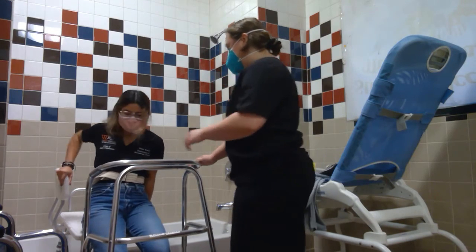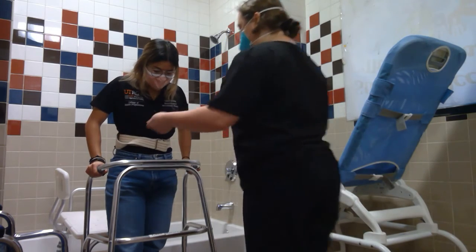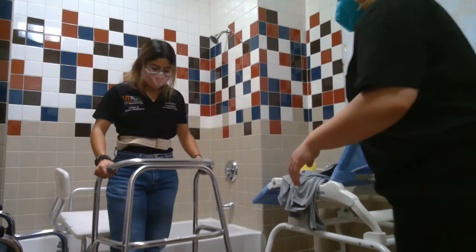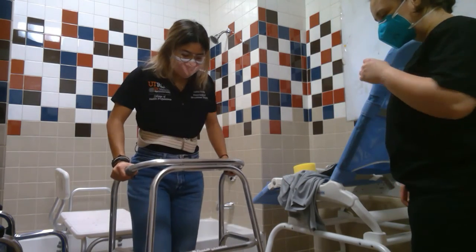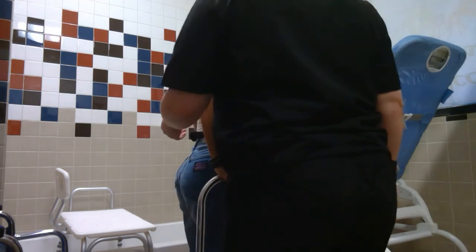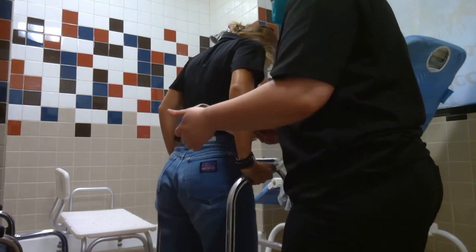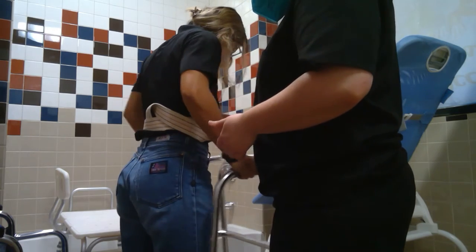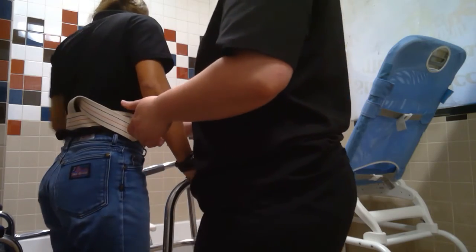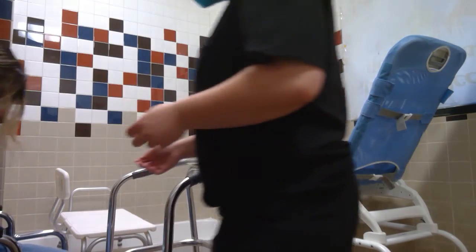All right. And so stand up. And you remember how to use the walker going forward? It's walker, weak, then my strong. Yes. And get that pivot. And then when I go backwards with my strong. Go with your strong first. All right, reach on back and sit yourself down. Great job.